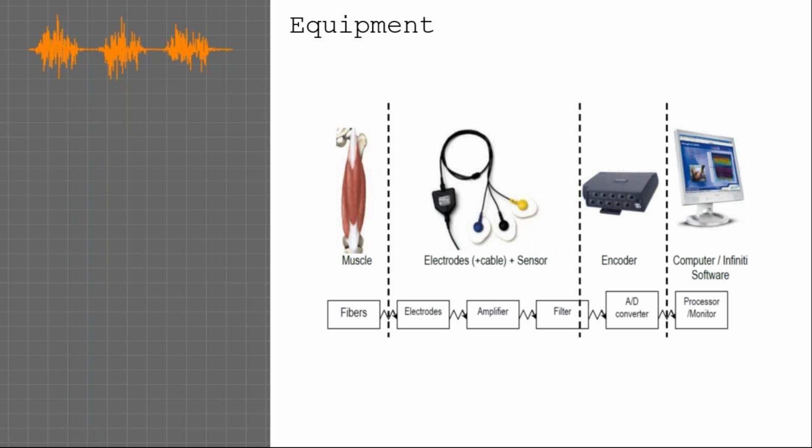I'm trying something new today, kind of going away from the way I traditionally do it. I'm going to talk about the software first. And again, it's all Thought Technology product. I guess that's a disclaimer. And then we'll get into what some of the hardware looks like.